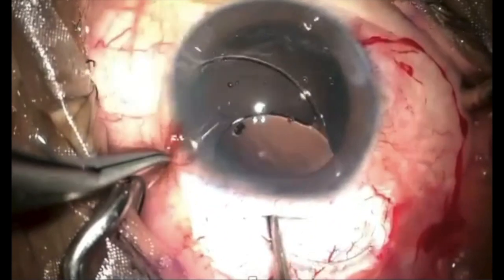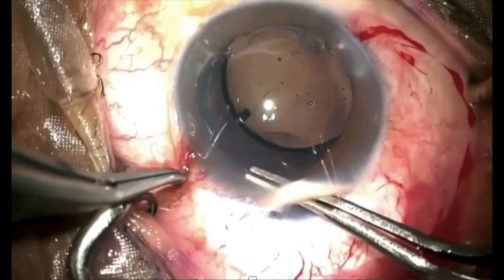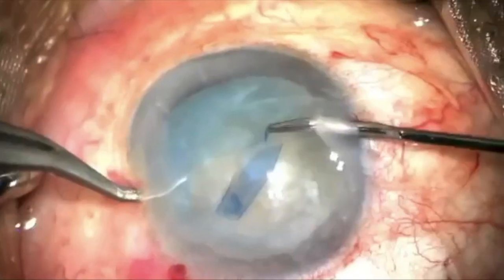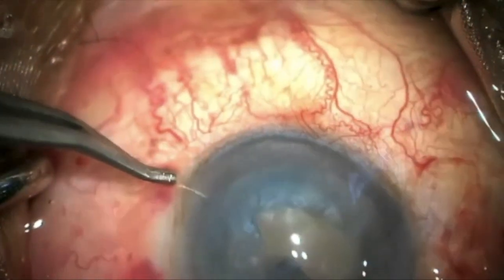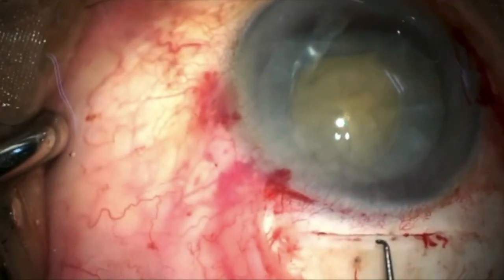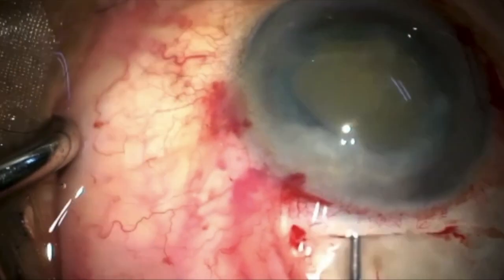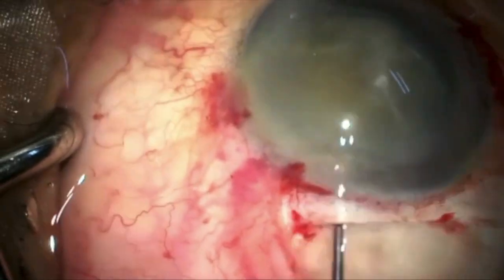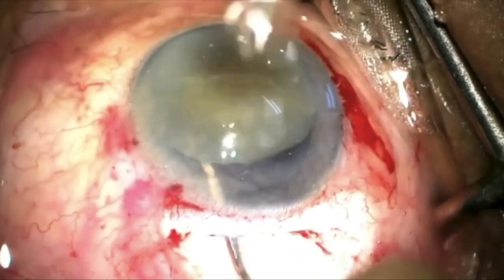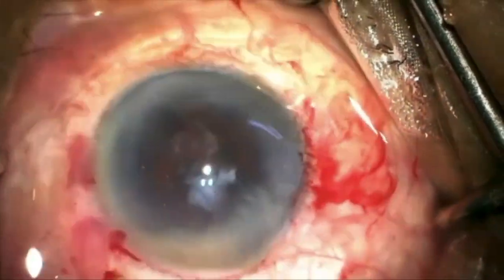This is followed by meticulous cortical removal and placement of a PMMA posterior chamber intraocular lens in the capsular bag. This is another video showing this technique in a hard, intumescent white mature cataract with shallow anterior chamber, low endothelial cell density and hazy cornea. After a 5 mm capsulorhexis, a few small nicks are given to prolapse such a large nucleus into the anterior chamber. Then the nucleus is effortlessly removed through hydroexpression using the 3-way cannula.